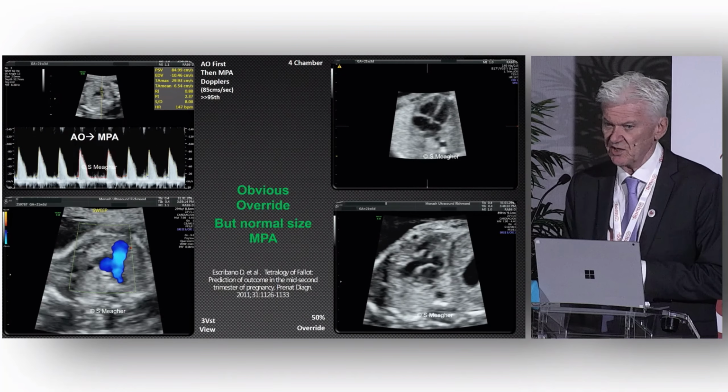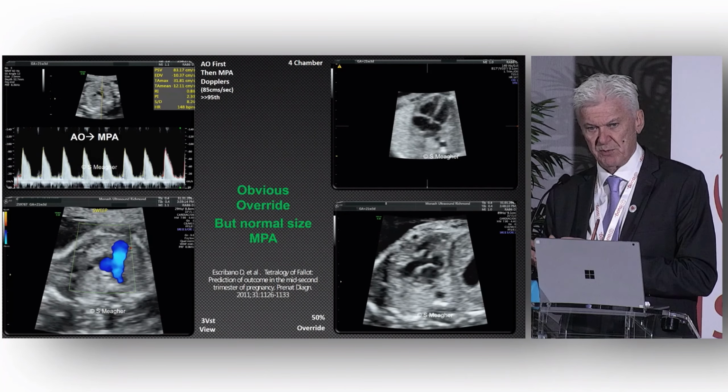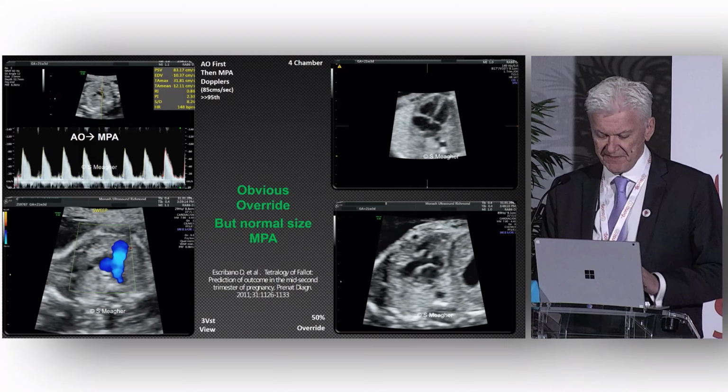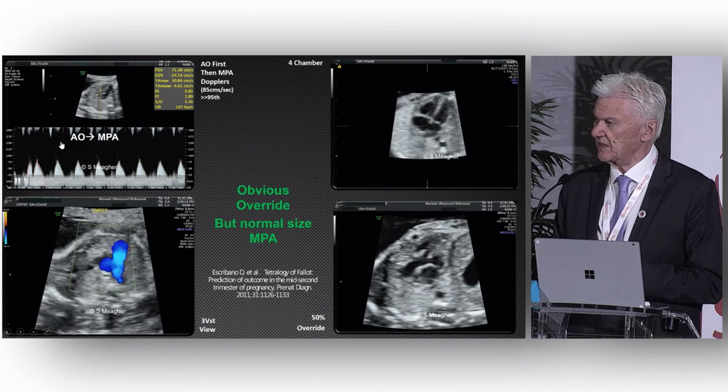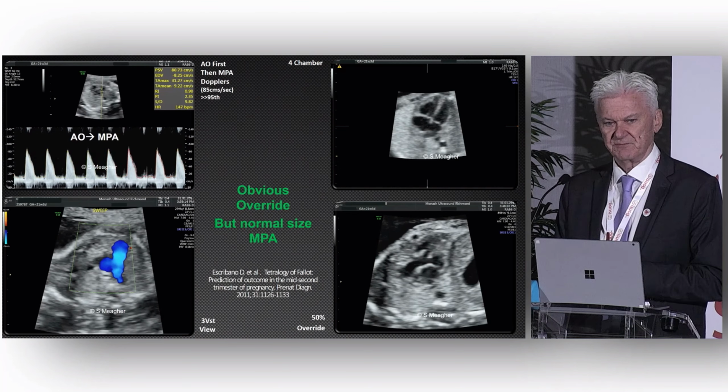You hear the difference. You hear the... then you swap over to the pulmonary, you hear choice. That Doppler comparison, simply listen again. Hear the difference in the sound?